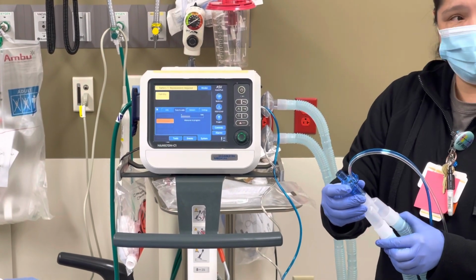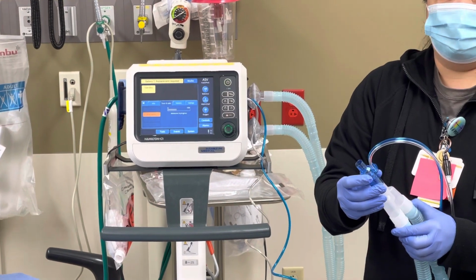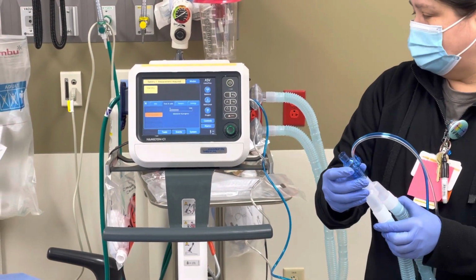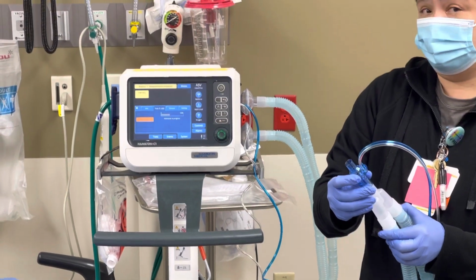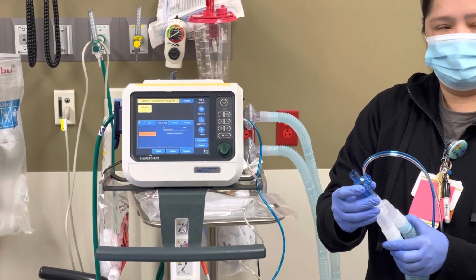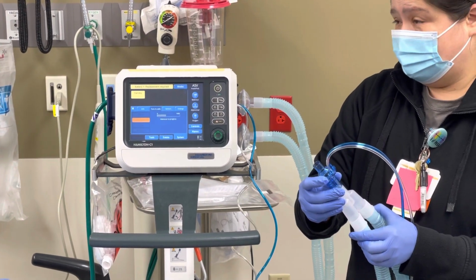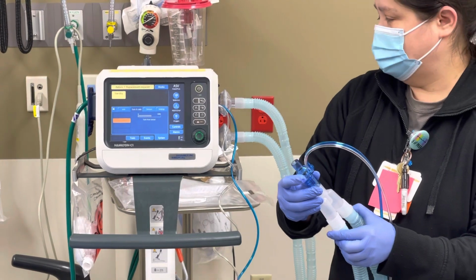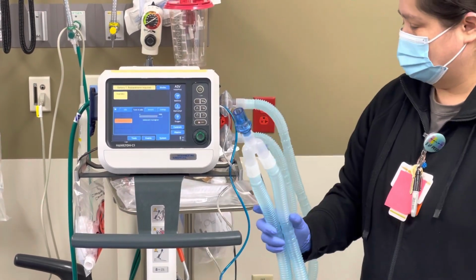Are we supposed to do this once a shift, or are we doing this every single time? It's every single time before we hook it up to a patient. Yes. And the reason is because you're trying to make sure that the flow sensor you put on is correct, and you're also trying to make sure that the circuit that you put on doesn't have any leaks in it and it's correct as well. So the HME stopped the flow from going through. So right here, you're just gonna turn it back through, and you just wait to do it again.